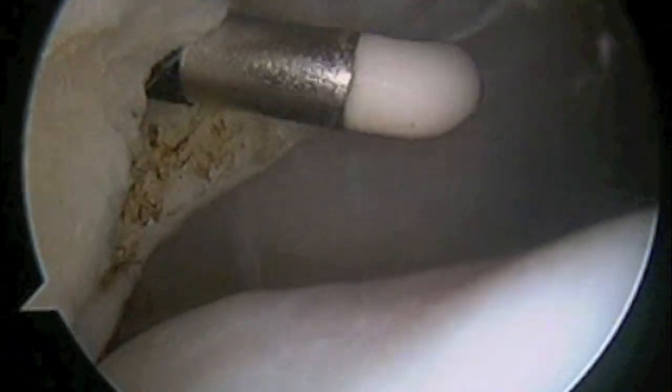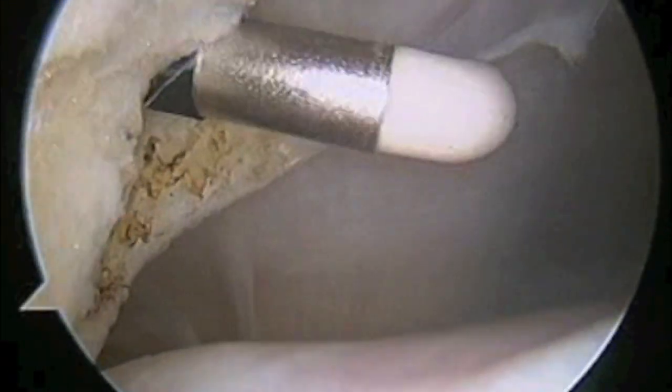Here we've inserted an arthroscopic shaver and we're excising that soft tissue or plica. As we do that, you'll begin to see how the space underneath the kneecap is opened up. You can see how the band of tissue runs from the medial joint capsule down to the infrapatellar fat pad, and we need to excise the entire length of that soft tissue so that it won't recur. Now you can see as we flex the knee, the kneecap runs in the groove with no soft tissue interposed. To finish it off, we use a surface probe to coagulate any bleeding, which will also decrease recurrence.